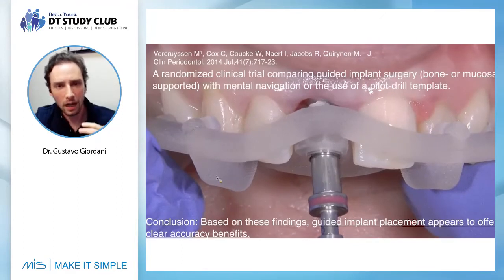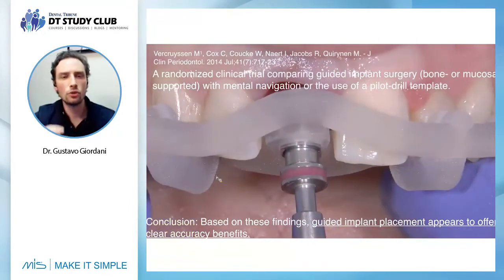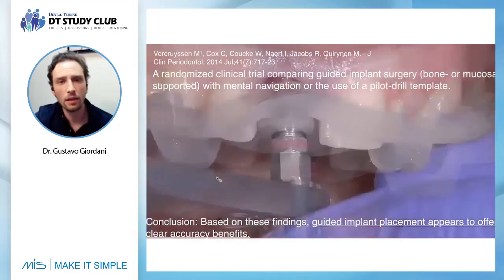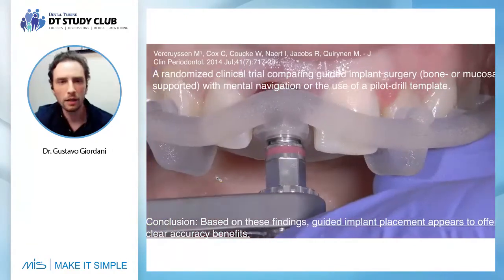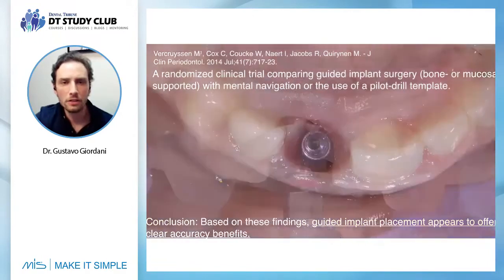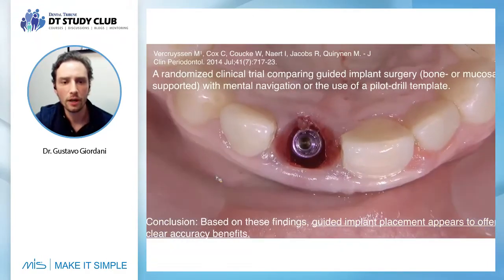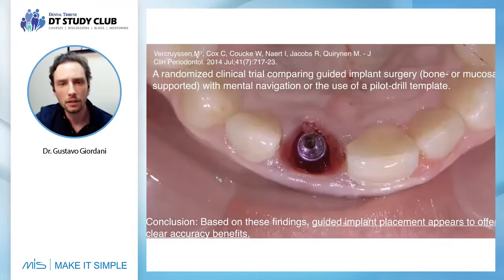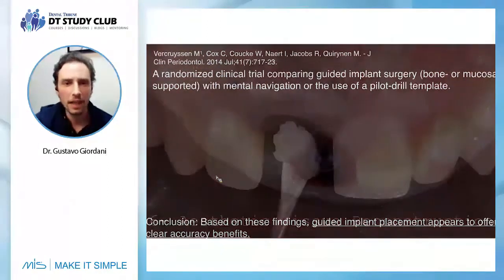No, you have a system that allows you to place the implant also guided, in a very safe and good way, and we finished the implant position for Monica's case using a V3, 3.9 by 13. Very good, very safe with the guided surgery.